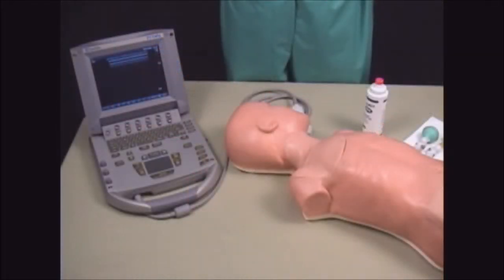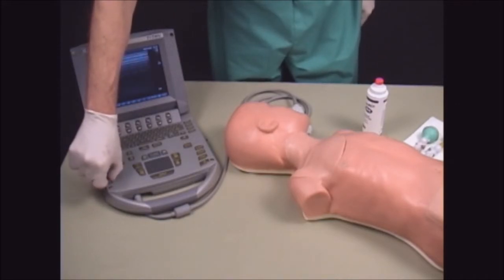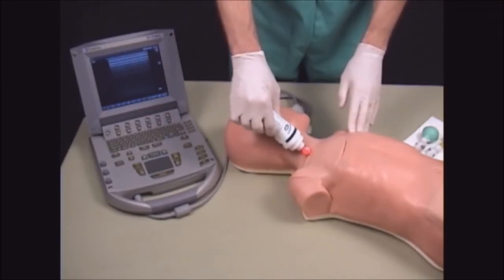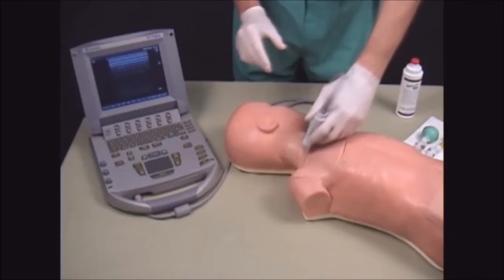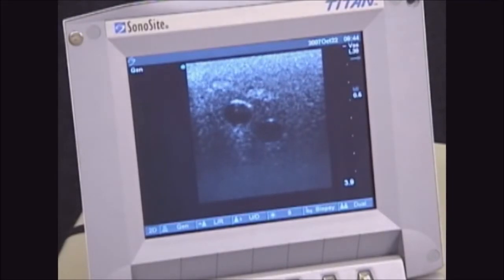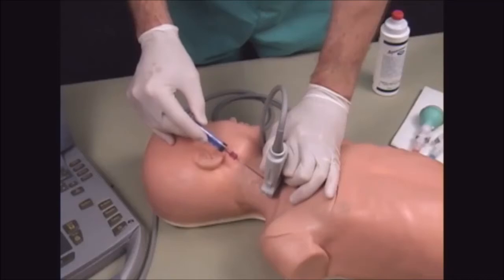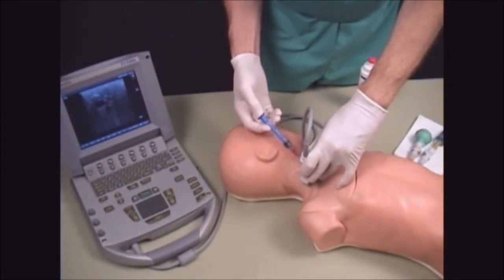An ultrasound imaging unit can be incorporated into this procedure. Begin by turning up the gain on the ultrasound unit and applying gel to the tissue before proceeding. Search and find the vessels on the imaging unit. Notice the realistic appearance of the tissue, vessel walls, and contrasting fluid-filled vessels. Simulab has made continuous improvements to its tissues to create the most realistic simulator.